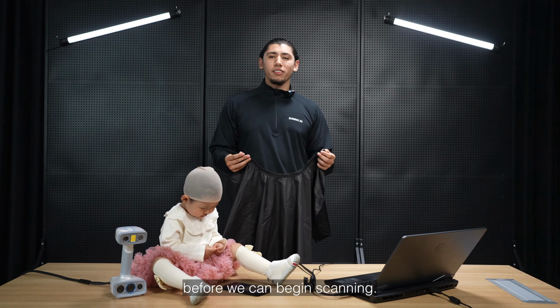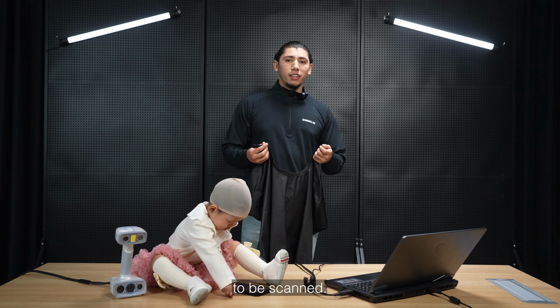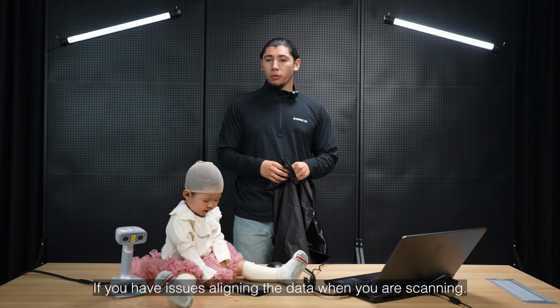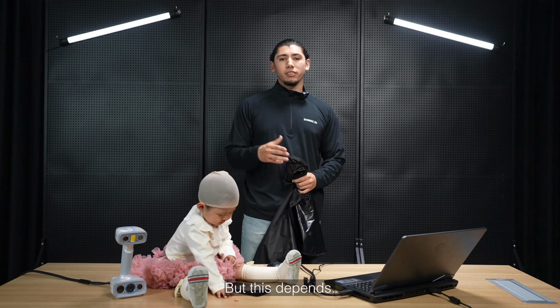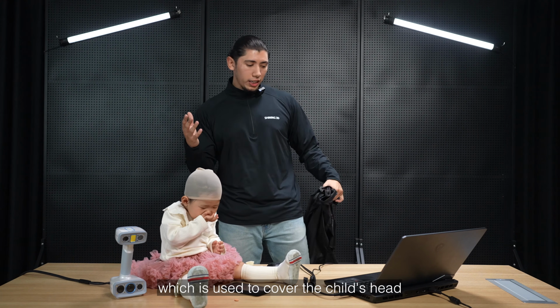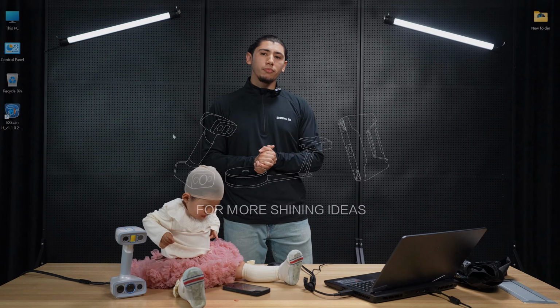Before we can begin scanning, it's important we prepare the patient, aka the child, to be scanned. Typically, we recommend using a black cape if you're having issues aligning the data when you are scanning, but this varies case by case. Next, we have a cap, which is used to cover the child's head to avoid the impact that hairstyles have on the head details.